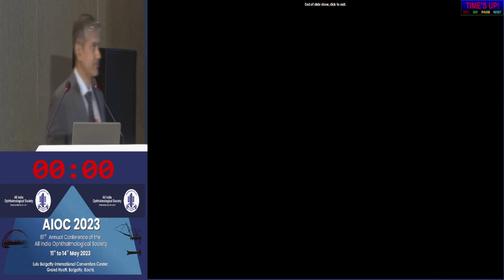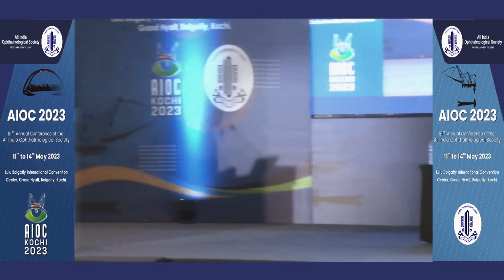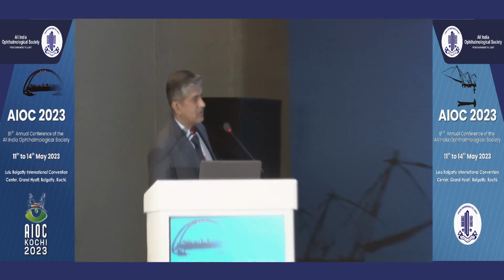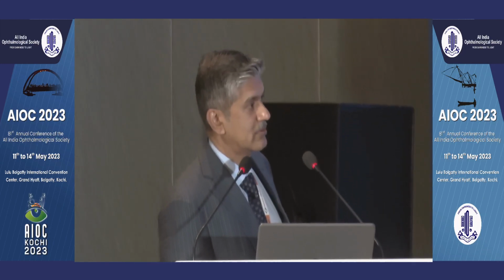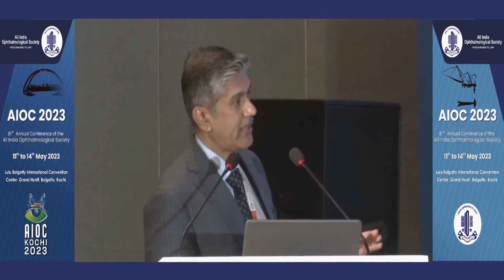Excellent talk, Dr. Sri Ganesh, sir. Sir, you're talking about the hyperopic SMILE. I think initially you started the study with the Visumax 500 for hyperopic SMILE. But what you are showing about the time, that is around 34 seconds. Even with the Visumax 800 also the time is the same for hyperopic? No, for hyperopic it will be within about 18 seconds. 18 seconds. So only with the Visumax 500 it was around 34 seconds. So chances of suction loss were quite high, like 1:150. That's what you are showing. So that's why the company has decided to make it available only on the 800 and not the 500.